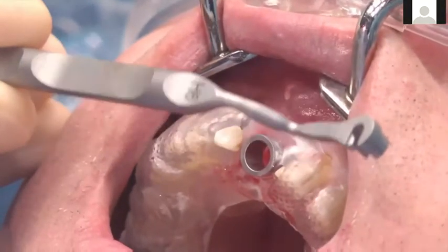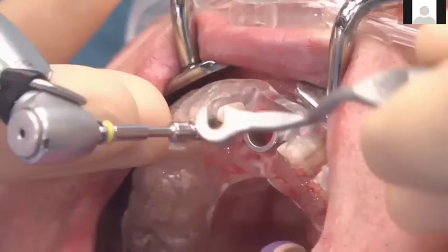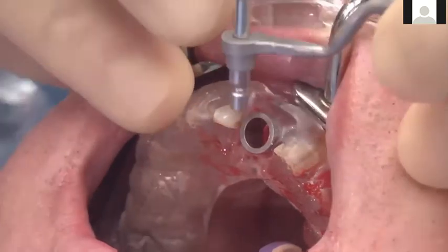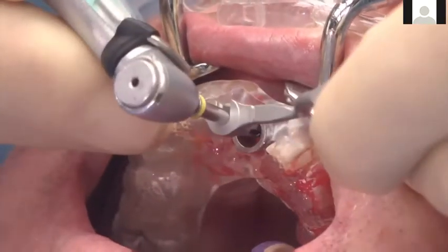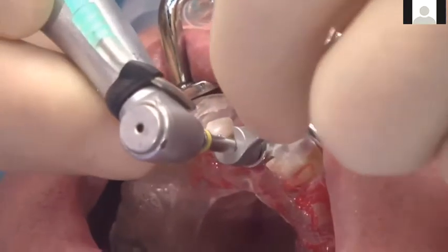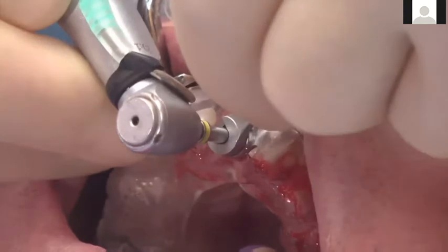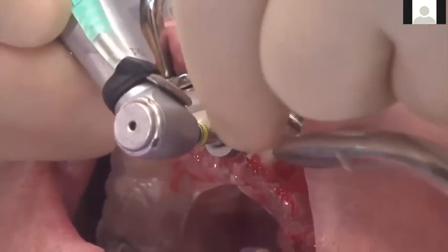If the bone is really soft, I may not go in all the way, but this uses a different handle. This uses a C handle where you put the handle onto the drill and then place the whole complex onto the guide. The Straumann users are familiar with this. This is the way this specific profile drill is inserted. So you put it first there, and then you put the whole complex on, and then you drill. In this case, I went all the way to depth because this was a pretty cortical site, especially coronally.